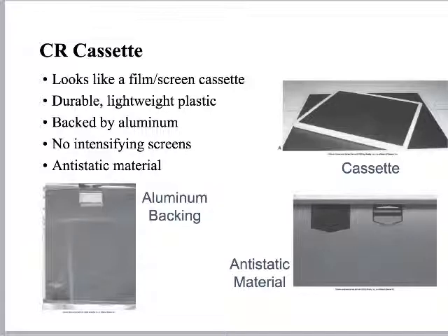So I said the film screen, it had the film sandwiched between two intensifying screens. In the world of CR, we do not need those intensifying screens that basically capture the X-rays and emit light. Now we're using this photostimulable phosphor. And since we're using the phosphor plate, and I said that static exposure to light could mess up our pictures, right? Back when we were still using dark rooms. The same thing is true with CR.